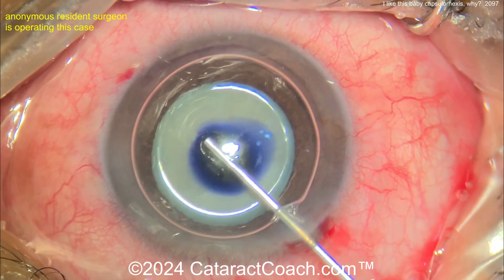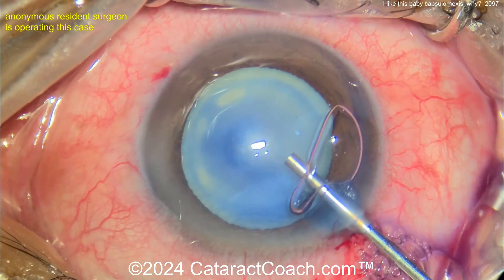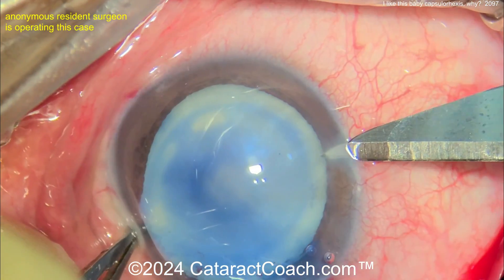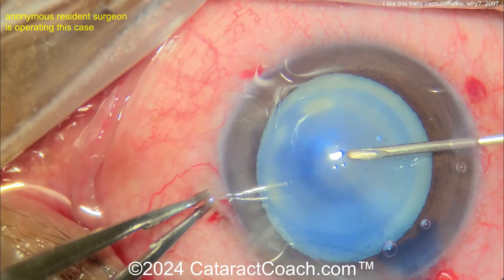So here's a white cataract, with an anonymous resident operating this case. Put a little trypan blue dye inside there, staining the lens capsule, filling the eye with some dispersive viscoelastic agent on the cornea too. Here's making the side port, looks like with an 11 blade, and now getting the rhexis done.